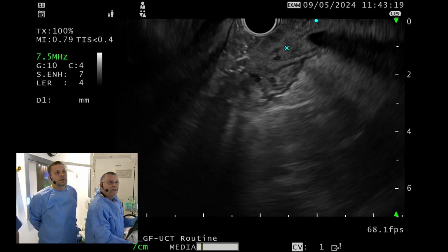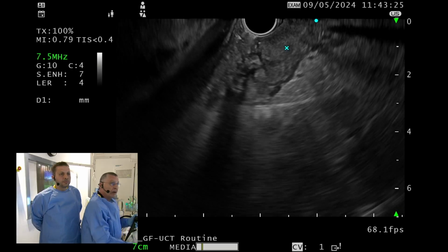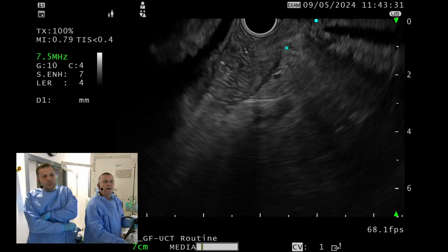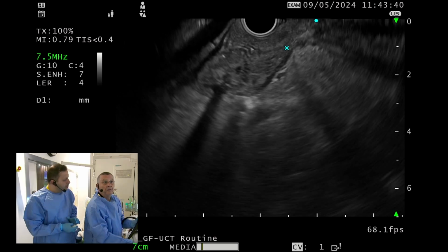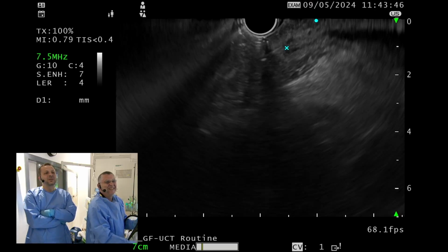What about distant lymph nodes? Yes, so our next move will be, and you can biopsy the node or biopsy the tumor. So, doctor, will the next direct step for us be fine needle biopsies? Fine needle biopsy of this. We're going to use the Trident Microtech needle, 22 gauge, of either the primary tumor or one of those lymph nodes. Any preference for you? Usually I do both. Okay, well, that's a good preference. Perfect. Thank you.